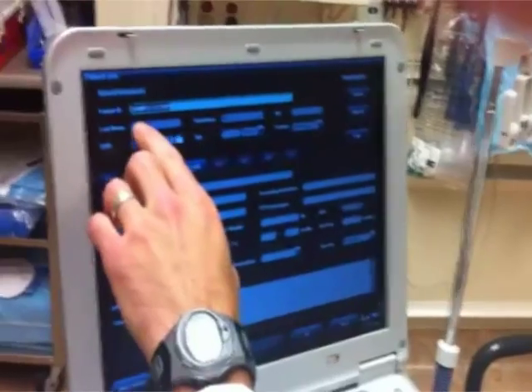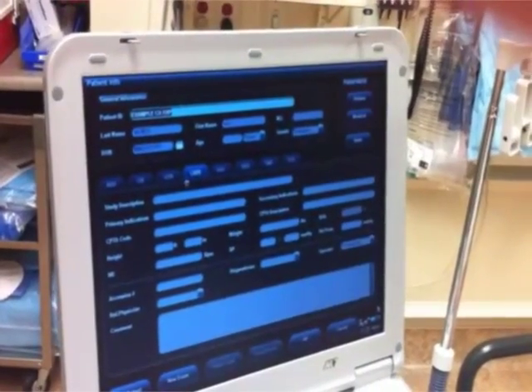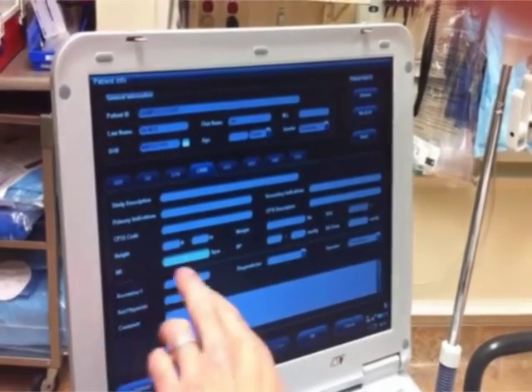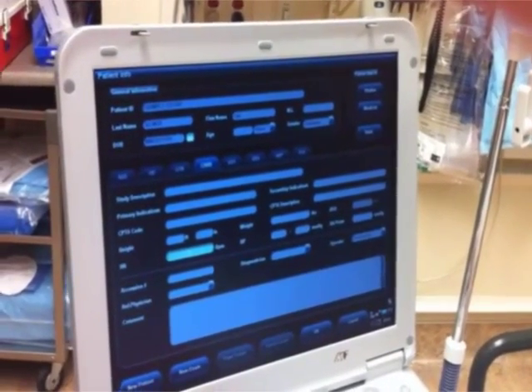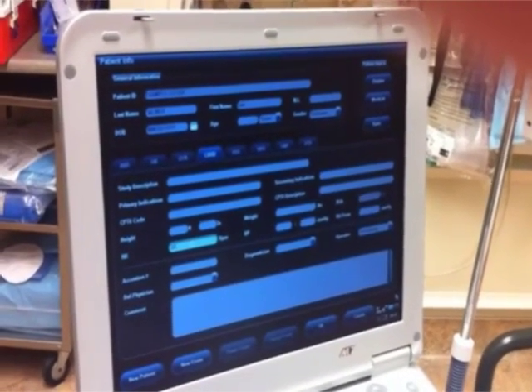So here I've just put in patient ID, example cardiac output. Of course, our patient's name is Val Kilmer. And then the only thing I really want to add in here is the patient's heart rate. So for argument's sake, his heart rate right now is 65, although normally I'd want to look at the monitor.